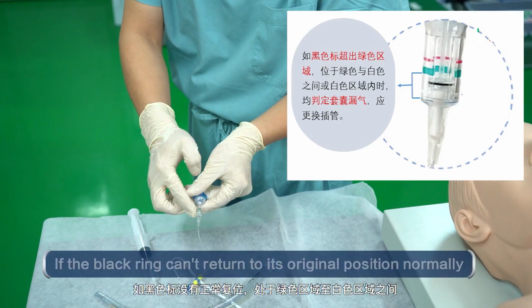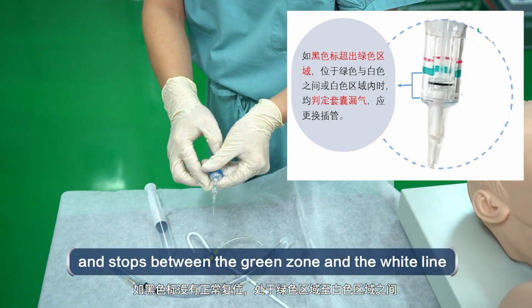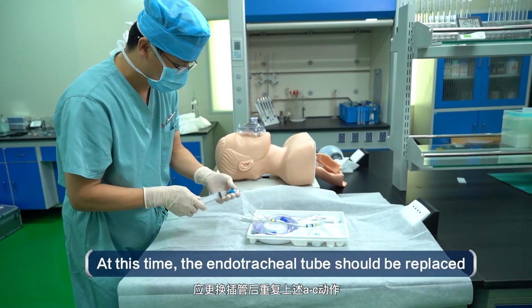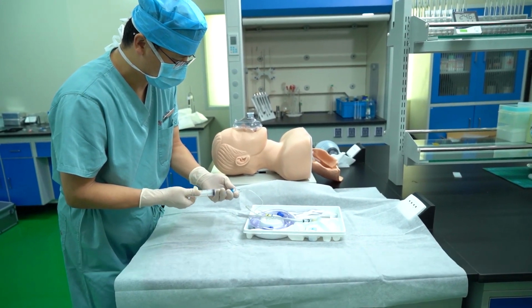If the black ring can't return to its original position normally and stops between the green zone and the white line, or on the white line, it can be judged that the cuff is leaky. At this time, the endotracheal tube should be replaced and tested again by repeating the above mentioned steps.